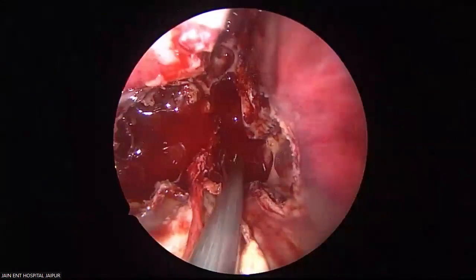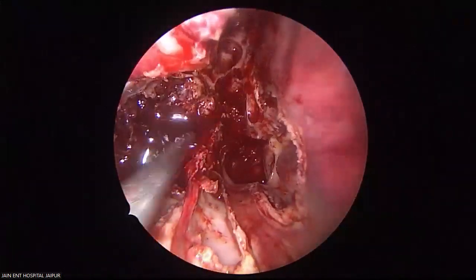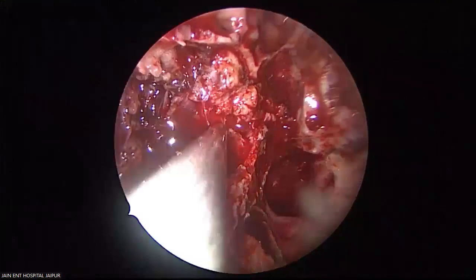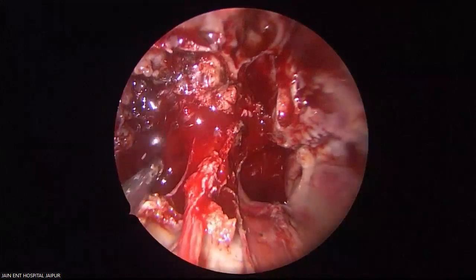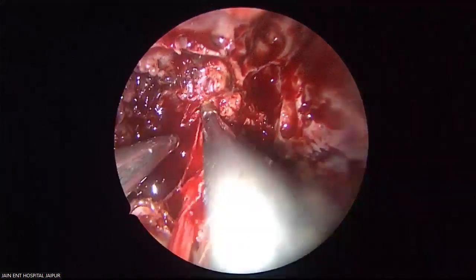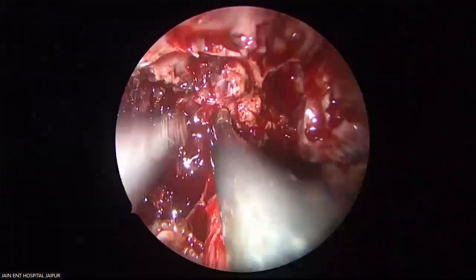See now with this suction, you can control any bleeder. That is the remaining tumor above. Little bit. See the infratemporal fossa surface.